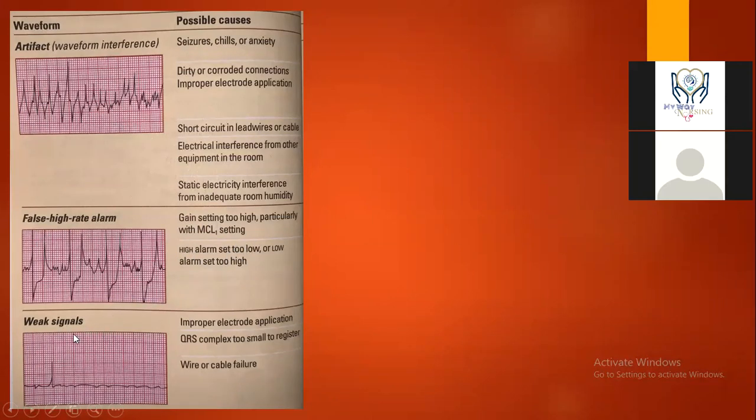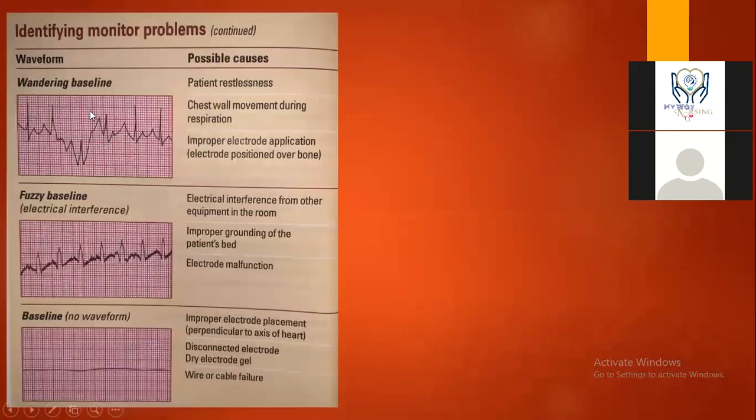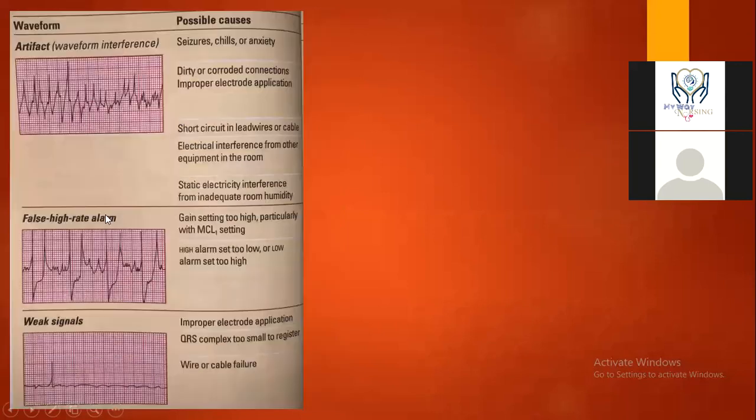And then we have weak signal. These are weak signals. It's not abnormal ECG. Okay, so just look at it, and if you see it in the future, remember it's not abnormal ECG, it's artifacts or a problem of monitoring.